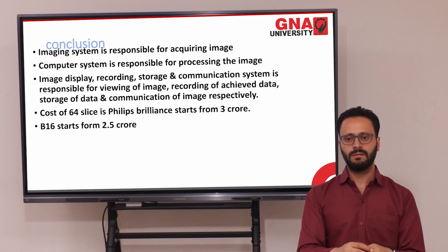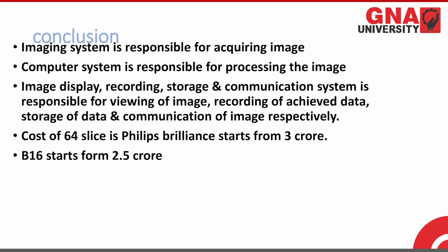In conclusion, we can say that the imaging system is responsible for acquiring the image, the computer system is responsible for processing the image, and display, recording, storage and communication are responsible for viewing the image, recording of archived data, storage of the data, and communication of the image respectively.